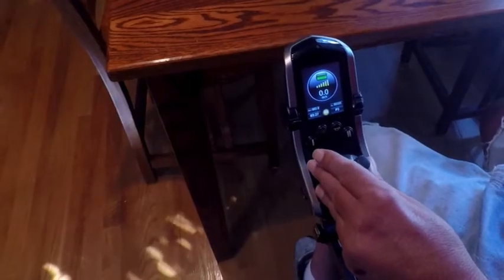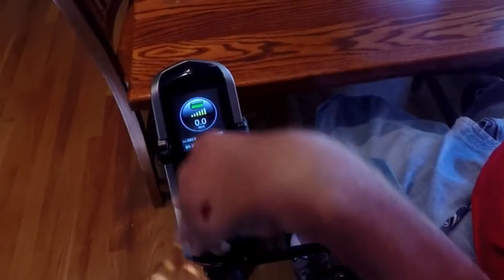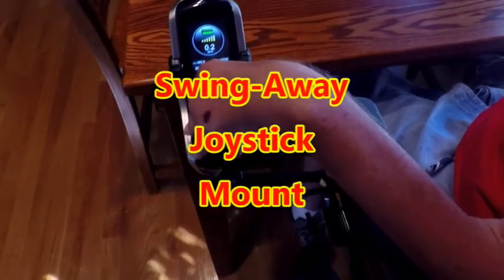Speaking of joystick controllers, if available, you should consider a swing-away joystick controller mount. I find it's necessary to swing the joystick controller off to the side when sitting at a dining room table to allow the power chair to be closer to the table. Although my typing skills are gone in my advanced stage of IBM, my one-finger keyboard computer punching is easier when the chair is closer and the joystick is swung out of the way, so I don't have to reach around the joystick to access the keyboard.